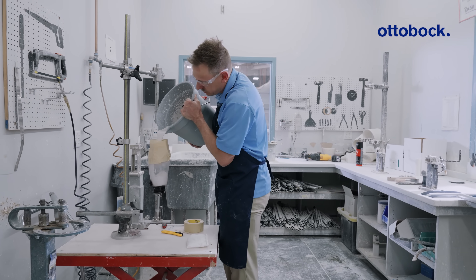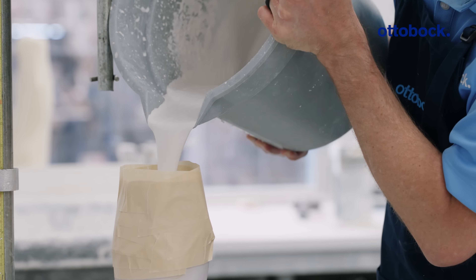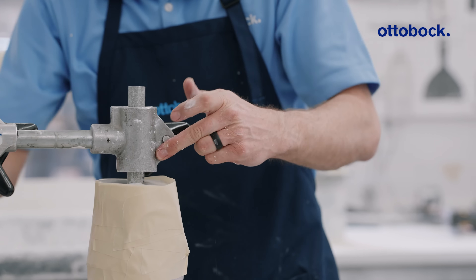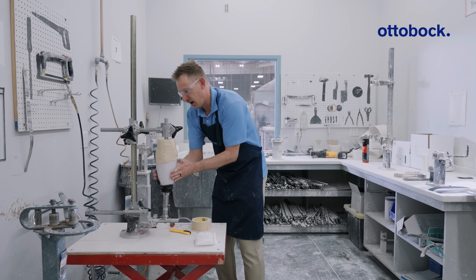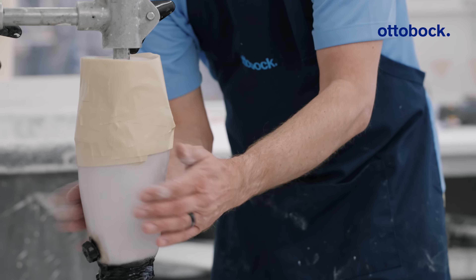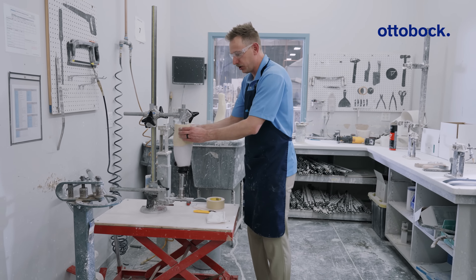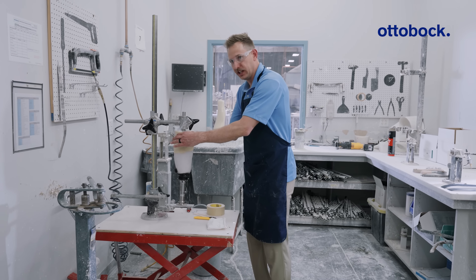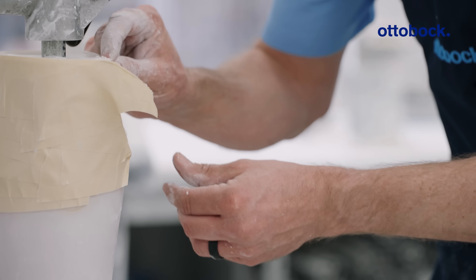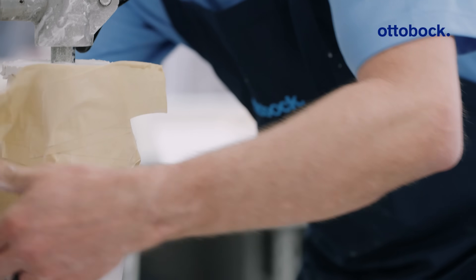Pour it in now and make sure you pour it higher than the top of the trim lines by at least one to two centimeters, then place in your mandrel. It's a good idea to vibrate out any air bubbles. Within about one to two minutes this is going to set up to where you can remove the tape. Be sure you're not walking away and coming back — you want to come back to it when it's still a little bit gelatinous but firm. Take a razor blade and place a cut down the middle and you can see the tape is pulling away even though the plaster is still a little bit wet. This is intentional.